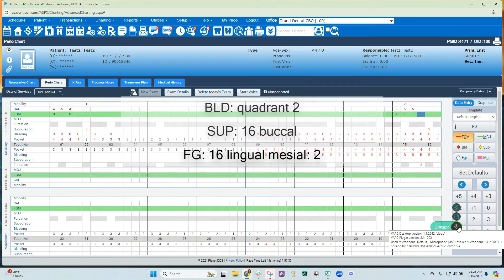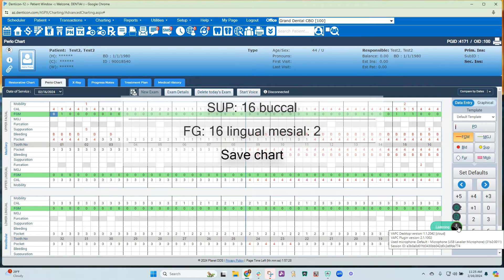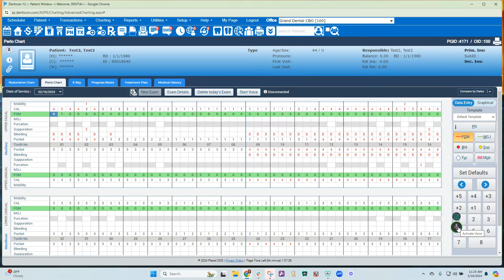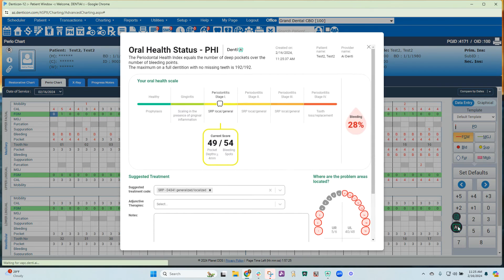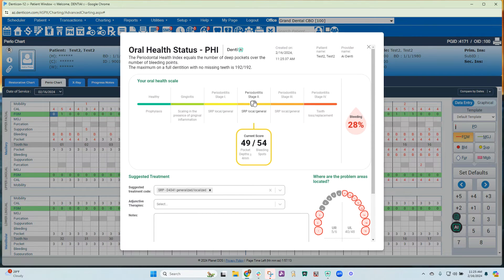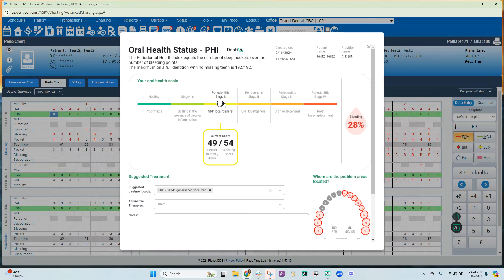Based on the clinical attachment level, it will drop the patient into a stage. If you look at the images and you need to adjust the stage, you can just click into a different area. I'm going to leave it at perio stage one.